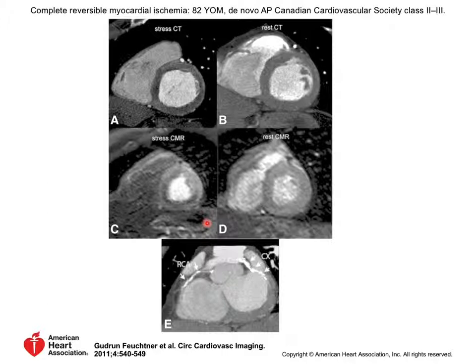So I would say of all of the imaging modalities that we have looked at, this is the way you should measure myocardial perfusion. MR seems to be the rock-solid method for doing this. So if the physiology works at all, i.e. the stress test works at all, then MR will be able to pick it up.